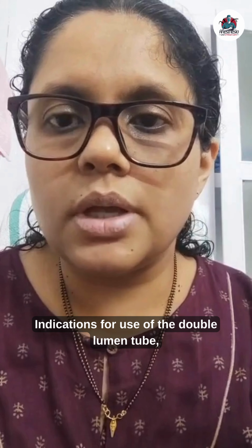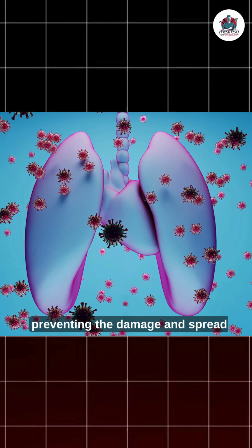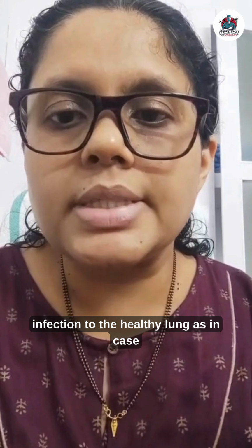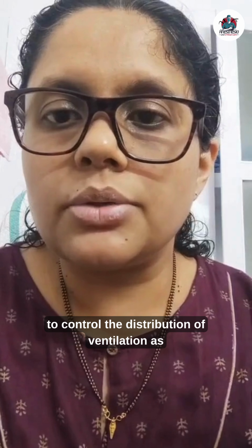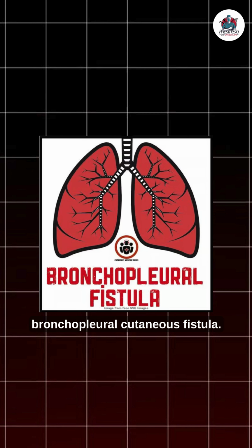Indications for use of the double lumen tube. Coming to the absolute indications: preventing the damage and spread of infection to the healthy lung, as in case of lung abscess and pulmonary hemorrhage. Secondly, to control the distribution of ventilation, as in case of bronchopleural or bronchopleural cutaneous fistula.